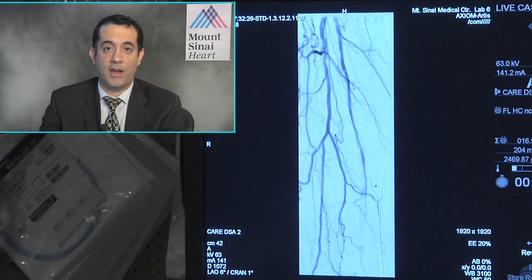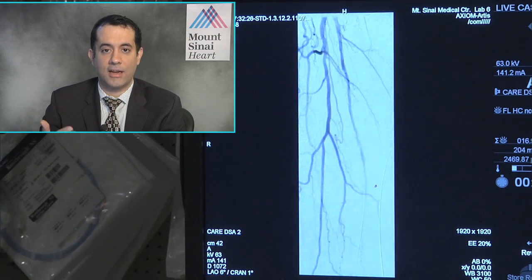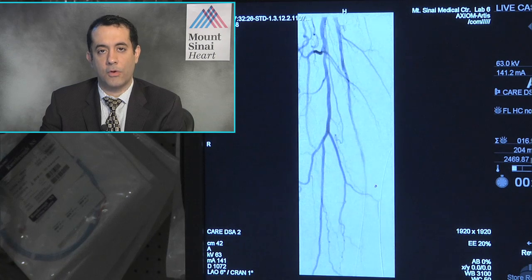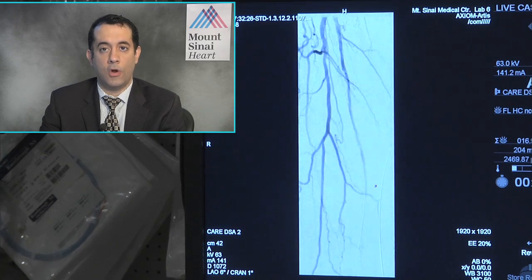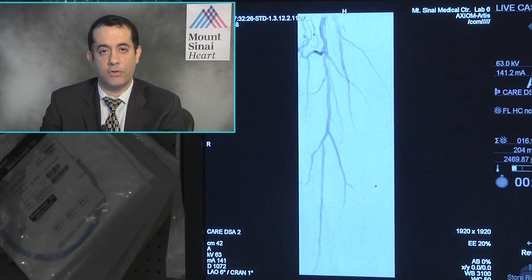So for me, if it's a very calcified lesion, I lean towards first, of course, doing atherectomy and then seeing the result. If the atherectomy result is very satisfying with minimal or non-flow limiting dissection, then I could go either DCB or Supera. But if there are focal areas which are very calcified, unyielding to non-compliant balloon and atherectomy, then I lean towards trying to do focal stenting of the calcified lesion, and for the rest we could do DCBs.